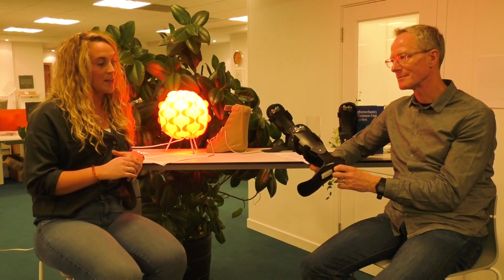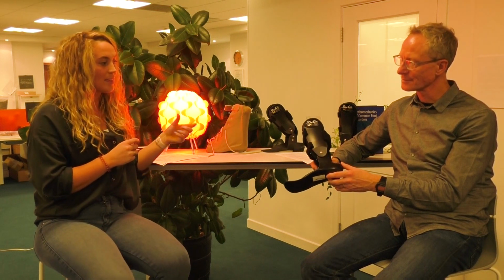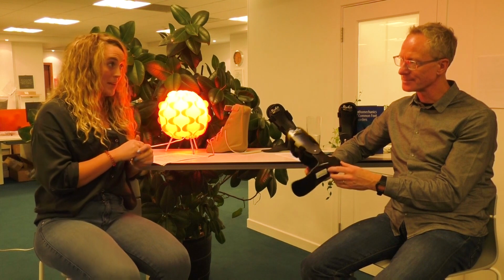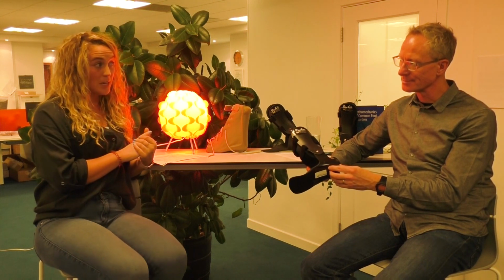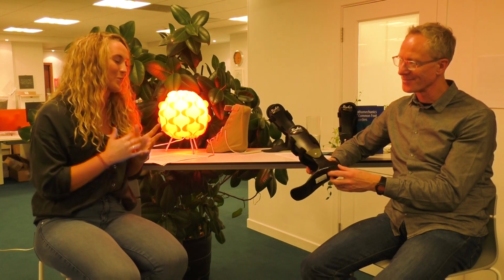But yeah, it was found that an AFO that was intrinsically balanced with a standard articulated hinge was the best at offloading the posterior tibialis tendon out of all the other treatment options for conservative treatment. So the Richie Brace basically was described, but without the brand name.